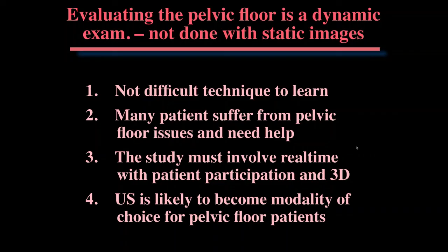So it says you feel that this should be a part of normal protocol. I don't think that it should be part of a regular gynecologic exam. I think that this should be done if a patient has symptoms there. We sort of taught ourselves how to do this in my practice, and we're starting to get patients referred. And it's starting to really be helpful to those patients.